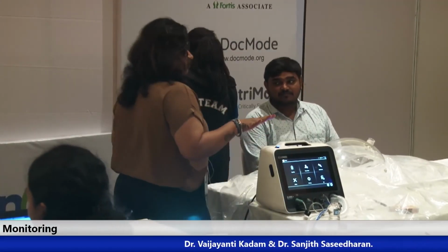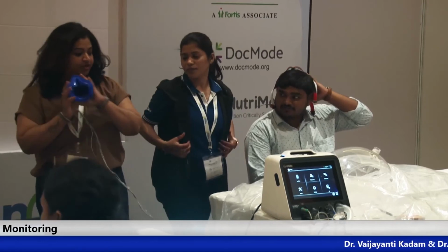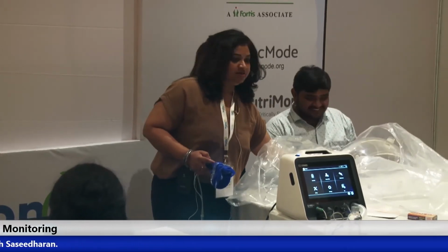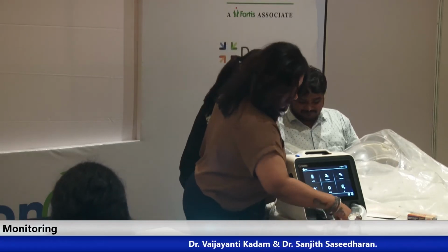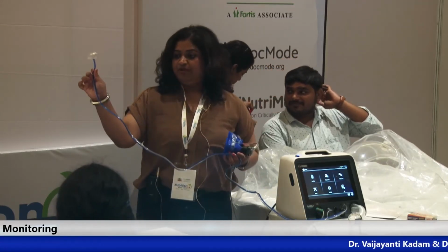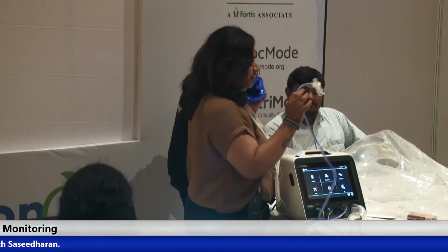Okay. So once we switch on this machine, these are the three modes in which we can use it. This is a mask mode. This is a canopy mode, which just goes over a patient who's sleeping, and we can calculate the energy expenditure. And we have a ventilator mode as well. Similar to this, it has a flow meter wherein the measurements of VCO2 and VO2 can be done and we get our results.